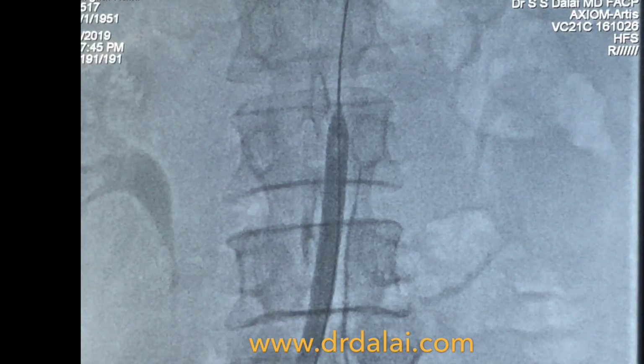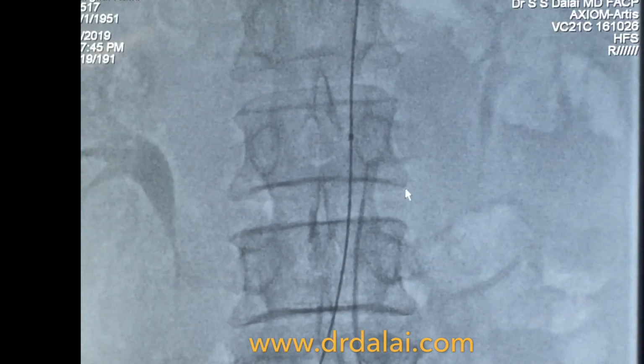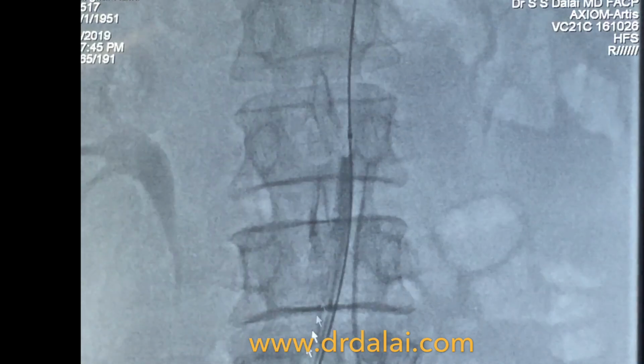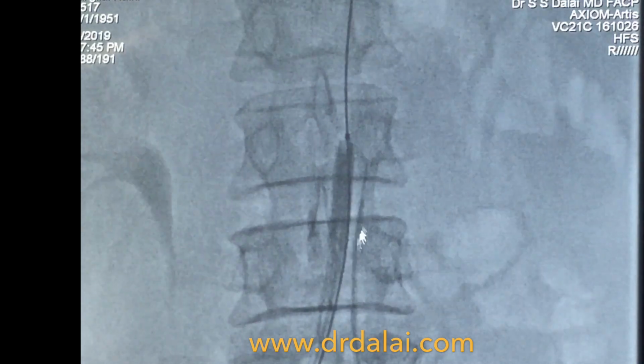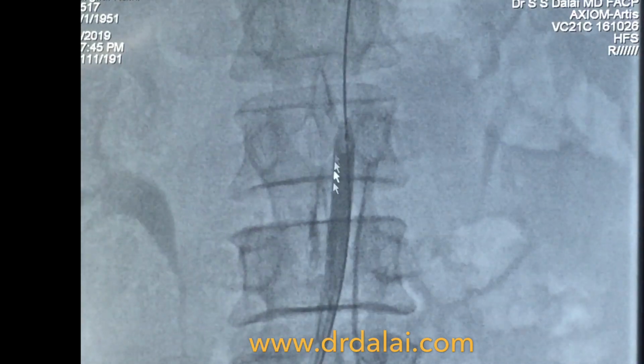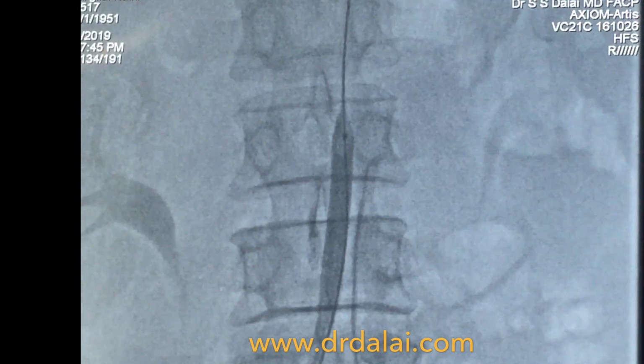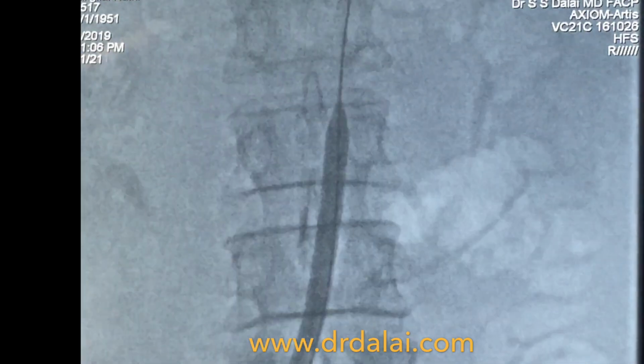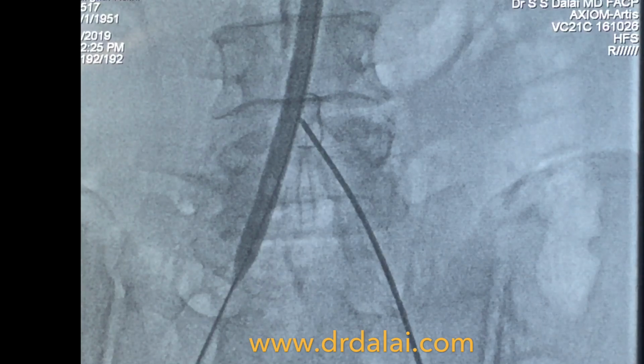the aorta, and so I'm trying to get inside this aorta, but every time. So I have put a balloon over here, we can see. So we're just dilating a little bit of the track, this occluded iliac and the aorta, and then I'm trying to go from the other side, and every time it is going subintimal, as we understand with significant experience of this particular disease. So we understand that it always tries to go subintimal. It's very difficult to come out.